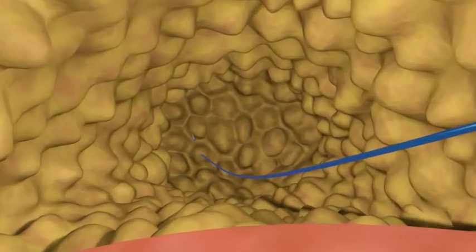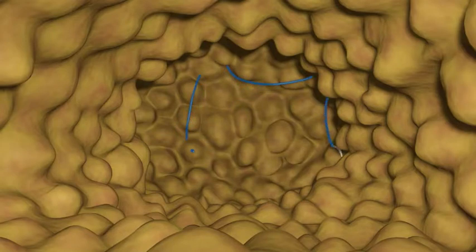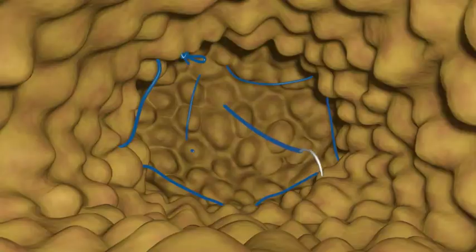Starting at the deepest point in the lumpectomy cavity and working in a circular fashion, advancing the suture upward toward the anterior-most aspect of the lumpectomy cavity, the marker is placed in a helical fashion. Once the anterior aspect of the cavity is reached, tie a knot, keeping the entire marker tension-free, and divide the marker close to the knot.